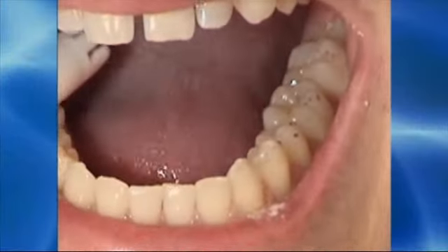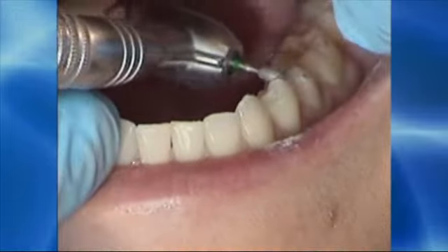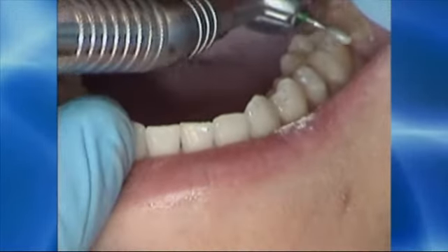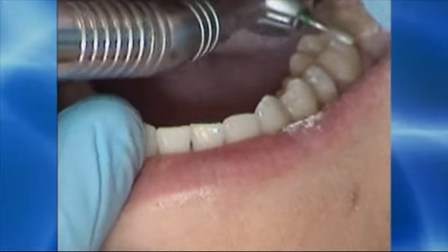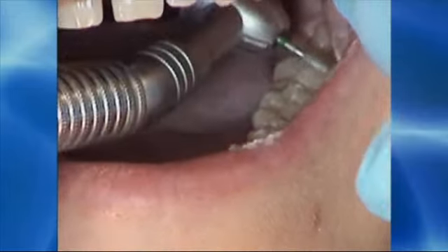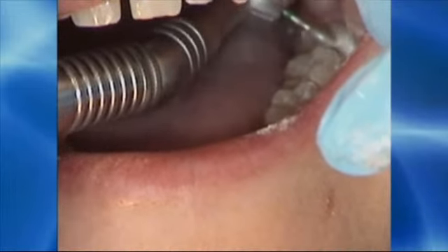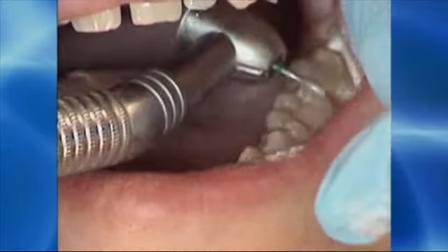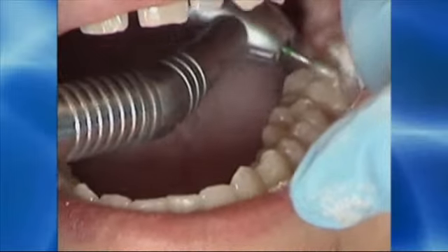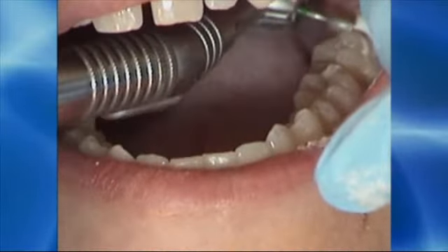On the opposing lower teeth, there are contacts that make up the long disclusion on the buccal aspect of all the posterior teeth. Here you see I'm working on the premolars, now the distal aspect of the first molar. And what I'm doing is trying to remove the contacts that are down on the buccal surface and shave the cusp back to eliminate the friction that's there and taper the shape of the tooth to the contact that's at the cusp tip. Here you see I'm refining the second premolar and then again the buccal aspects of the two molars. And now I'm going to treat the balancing incline on the distal buccal cusp of the lower second molar.